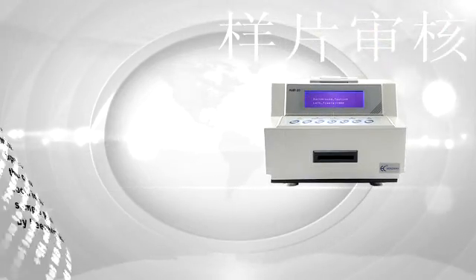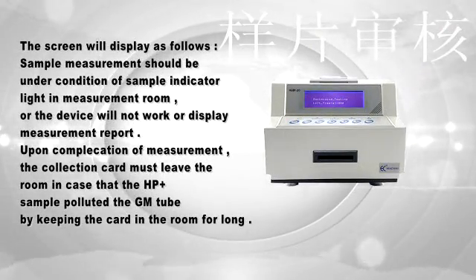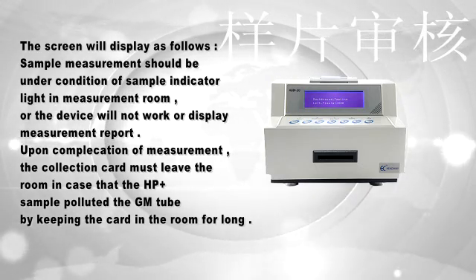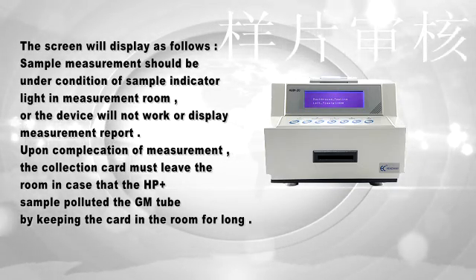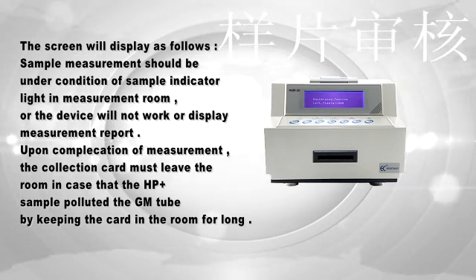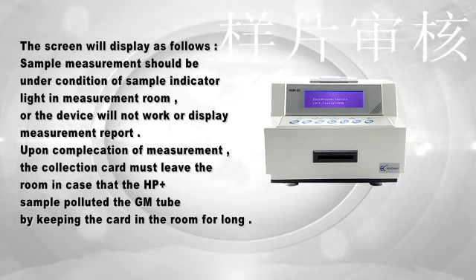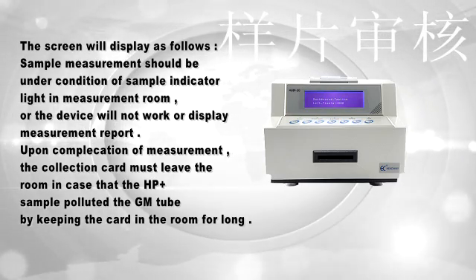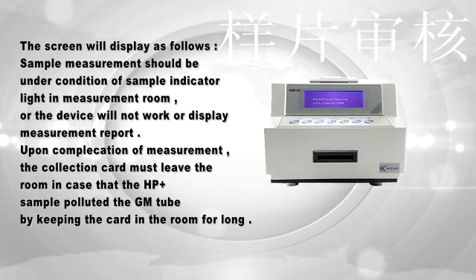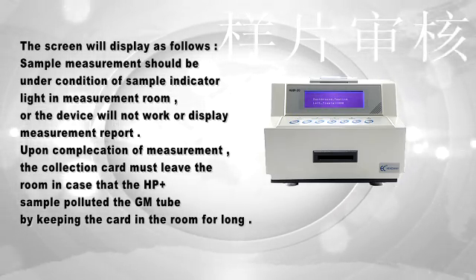The screen will display the following precautions. 1. Sample measurement should be performed only when the sample indicator light in the measurement room is on; otherwise the device will not work or display a measurement report. 2. Upon completion of measurement, the collection card must be removed from the room to prevent H. pylori-positive samples from polluting the GM tube by leaving the card in the room too long.